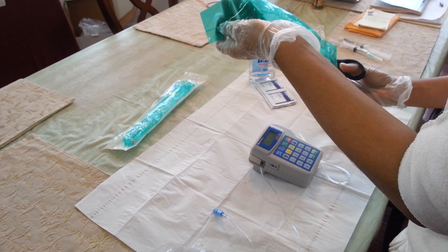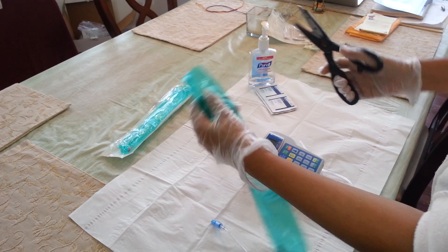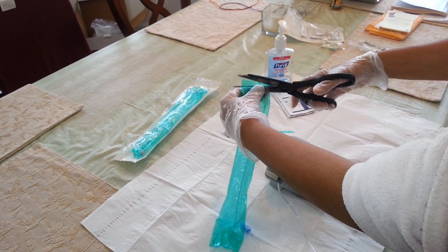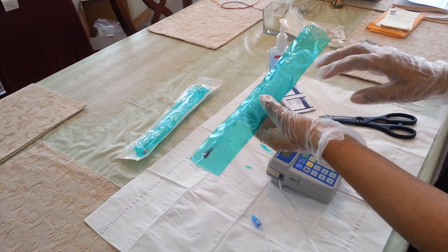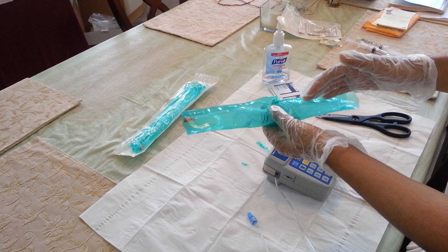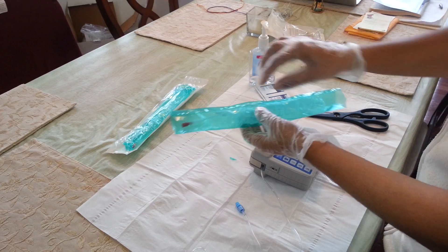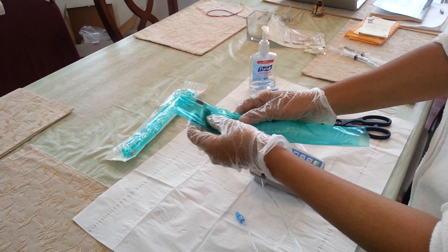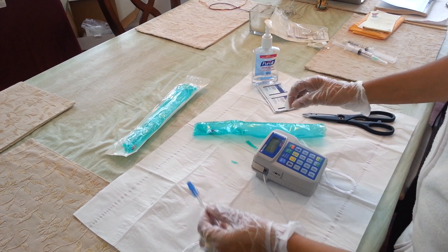Before I open the tubing, I make sure that the caps are in place — this is very important. When we started using the Wigon tubing, we realized that it starts to entangle and it is difficult to walk around. This is a great tip that has worked for us: we let the tubing stay in the green packaging that it comes with, and we just take out the protective ends and connect them to the Curlin tubing. That is what I am going to show you now.